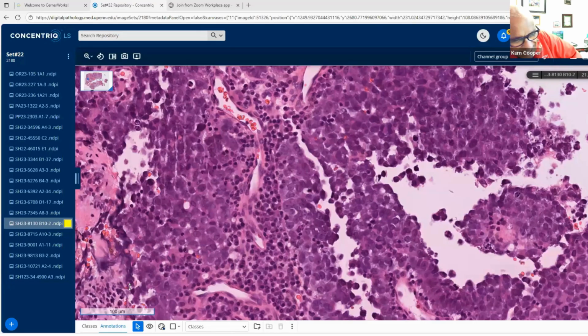This is melanoma, and the reason I'm being so difficult in giving you the answer is that you have to consider melanoma in all sites of the body. Think about S100, SOX10 and the melanoma markers. Here, if you think of the mnemonic, melanoma is number one there, right? M for melanoma. So in thinking about that, always consider melanoma.